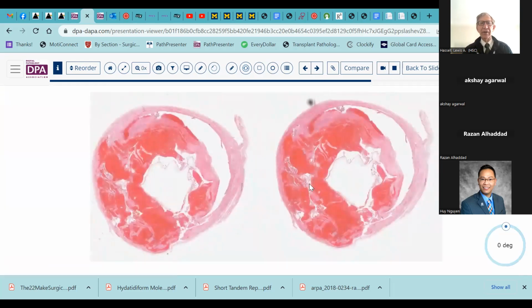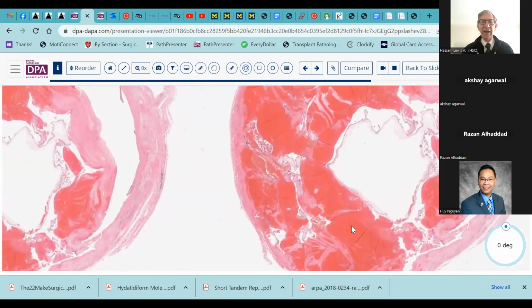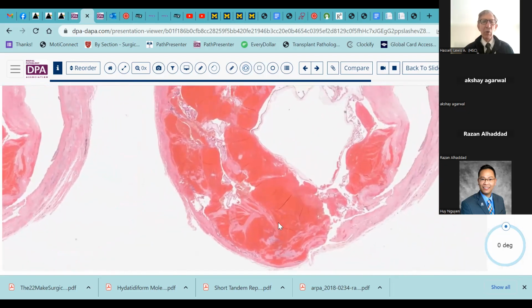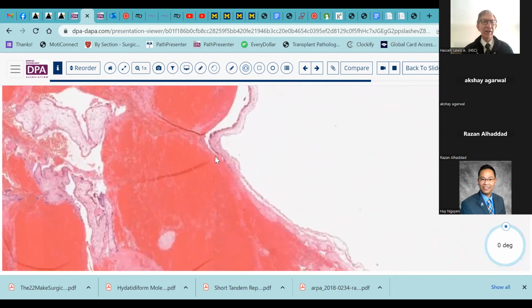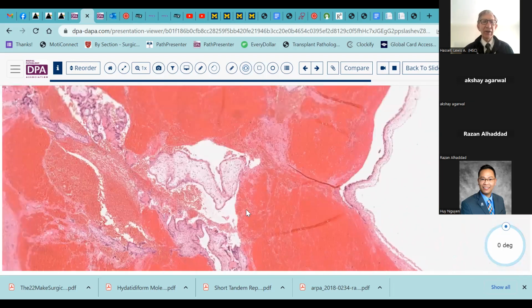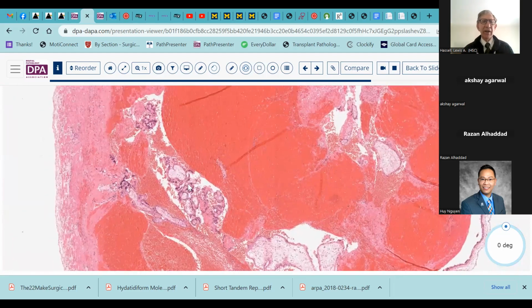Okay, so another tube, slightly dilated, this one very hemorrhagic. And so, before we make a diagnosis of hemosalpinx, we need to think about what causes that. Well, certainly the most frequent cause of that is this entity here, where, as you can see very nicely, we have chorionic villi.